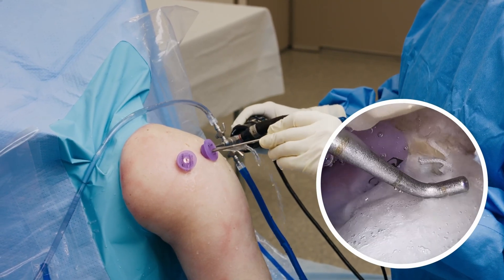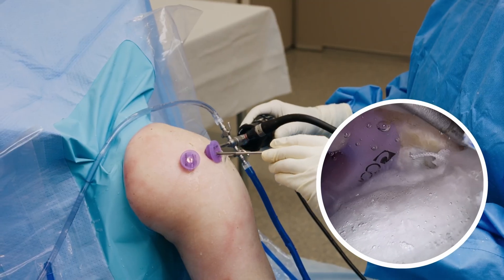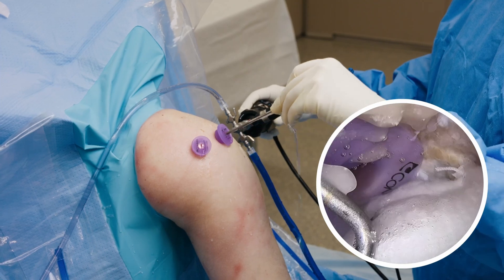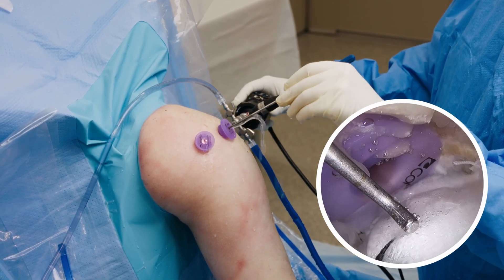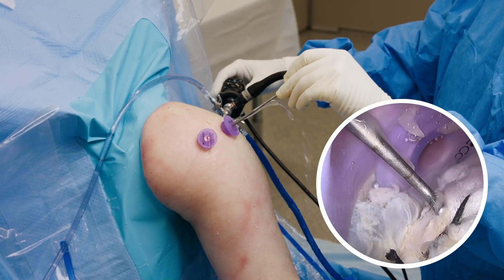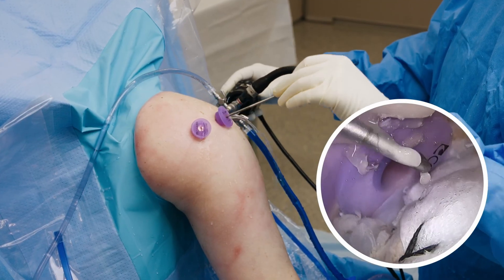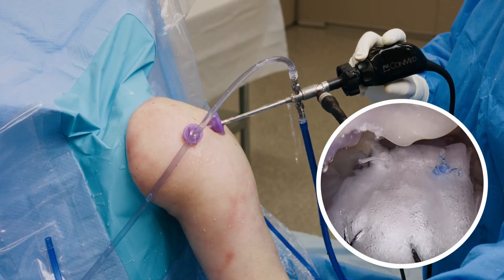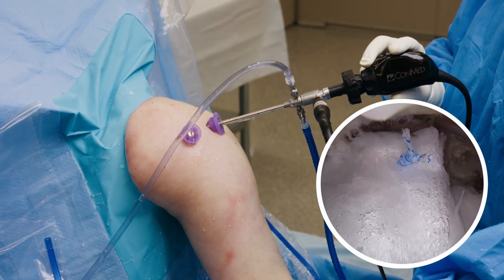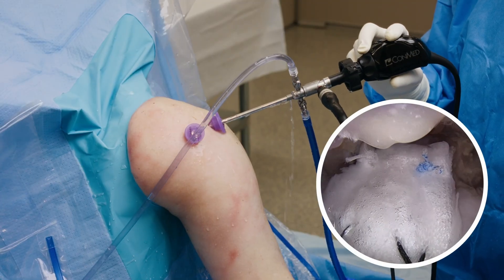You can see in this arthroscopic image that we have appropriately covered the repair site. We're getting excellent mechanical strength to this construct, as you can see with that tight tension throughout the biobrace RC with our medial and lateral fixation points. With the porosity of the biobrace device, we're also going to get excellent biologic facilitation for healing with this augmentation procedure. As I move the arm, you can see that this is an excellent fixation construct that I'm very pleased with and will help this patient heal from their rotator cuff injury. Thank you very much for your time and attention to this video.